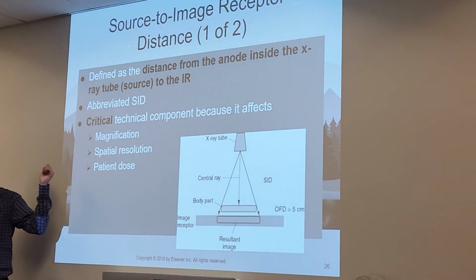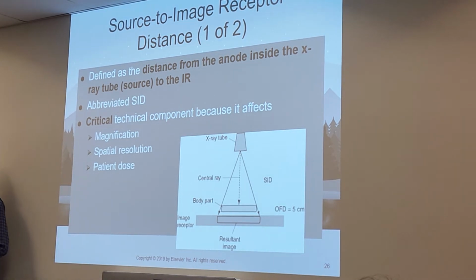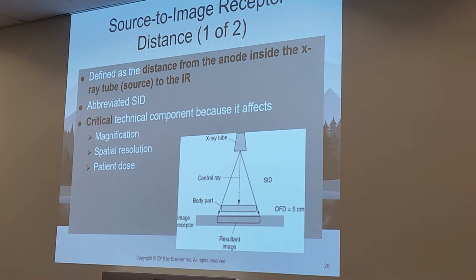SID can also affect what kind of energies you choose for your X-ray beam. SID can affect which grid you choose to put on top of your image receptor. And so SID is very, very important.